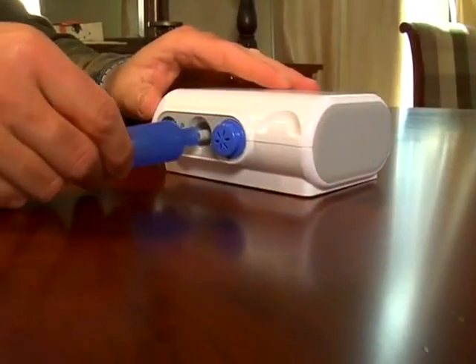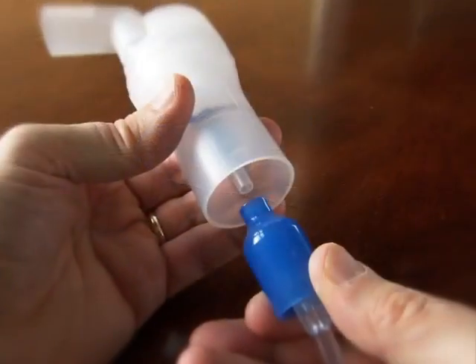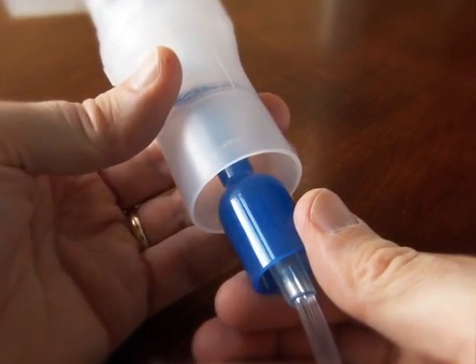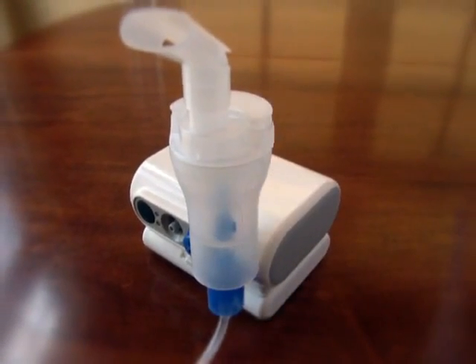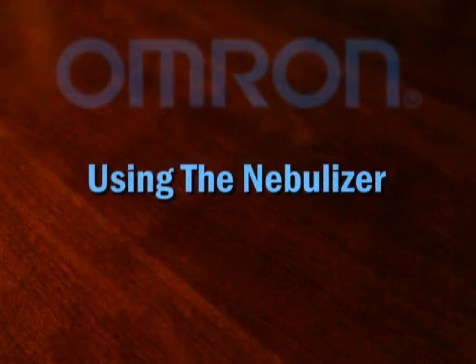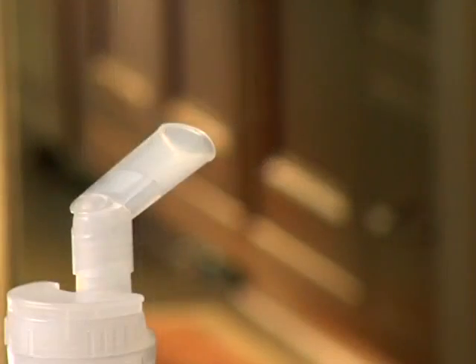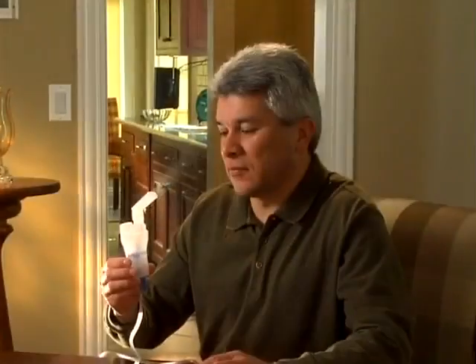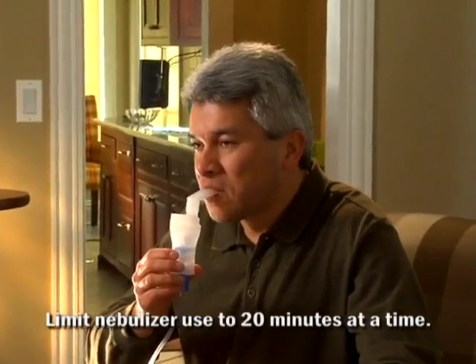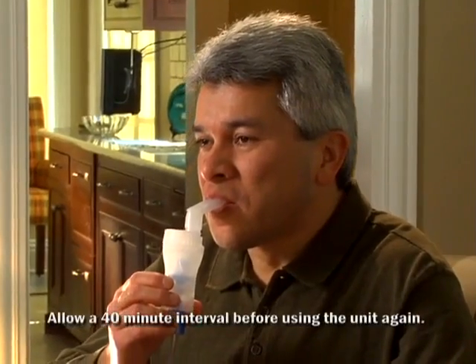Now, securely attach one end of the air tube to the air connector on the compressor and the other end to the air tube connector on the medication cup. You can always use the nebulizer kit holder as a temporary holder for the nebulizer kit. Press the power switch to the on position. When the misting begins, place the mouthpiece in your mouth and inhale the medication according to your health care provider's instructions. Breathe normally, inhaling and exhaling through the mouthpiece.